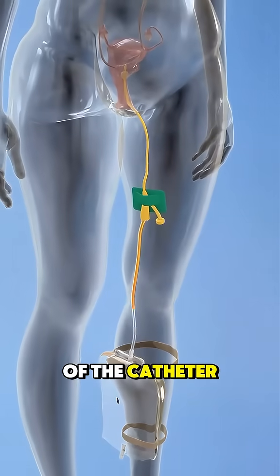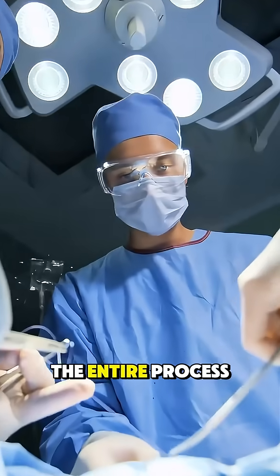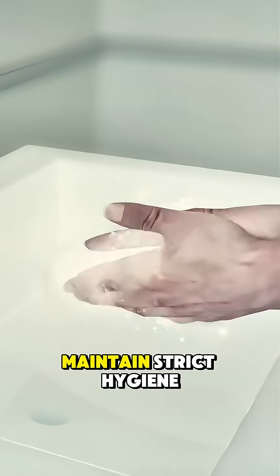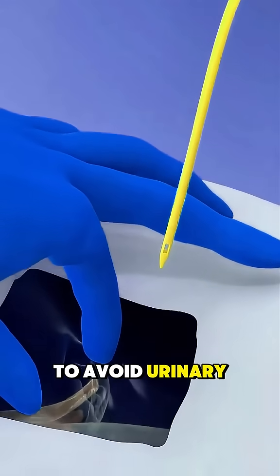The other end of the catheter is connected to a drainage bag, which collects the urine. The entire process is usually quick and causes only mild discomfort. It's important to maintain strict hygiene during and after insertion to avoid urinary tract infections.